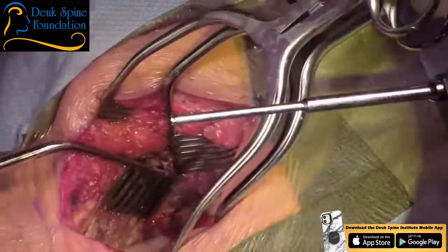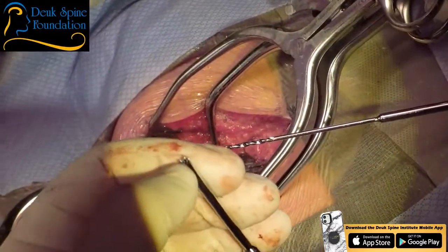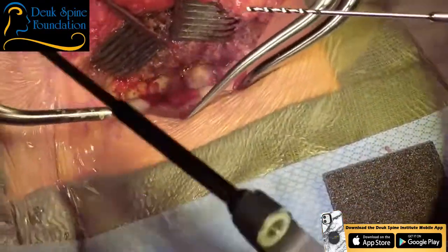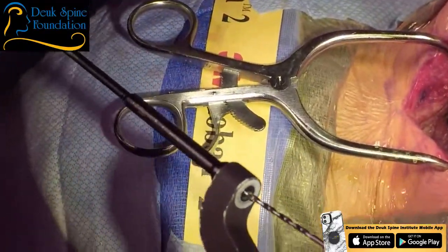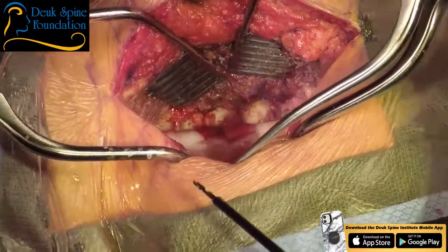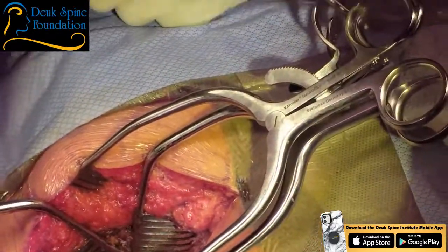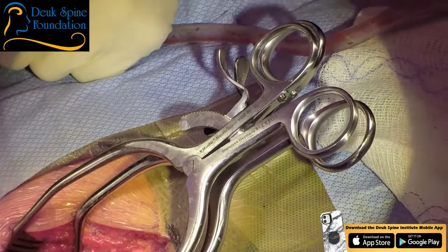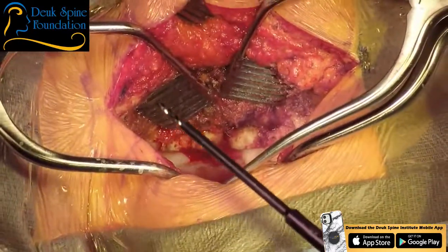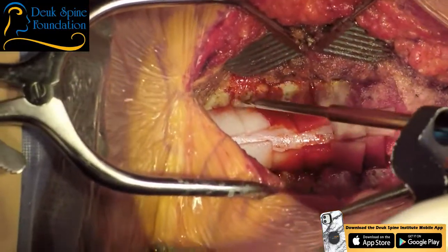Now, one of the reasons I told you I like this particular company is you see this drill bit, this guide? It's got these little spikes here. And they look just like spikes, but they actually are pointed outwards. So I have, my wife and I, we have these dogs. They're called Dachshunds. And they were really engineered by the Germans to hunt badgers. And if you've ever had them bite you in play, you'll see that their front teeth are pointed outward, forward. So they can actually grab a badger's hair or a badger's leg, whatever, and pull them out of the hole. So these teeth are also angled outward, so they grab onto the bone and they hold it. So usually they don't slide.